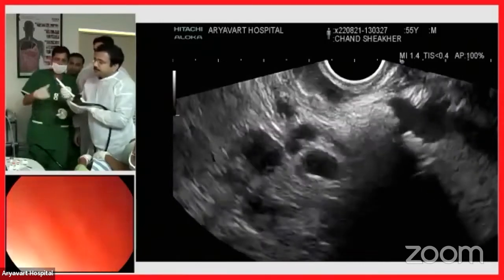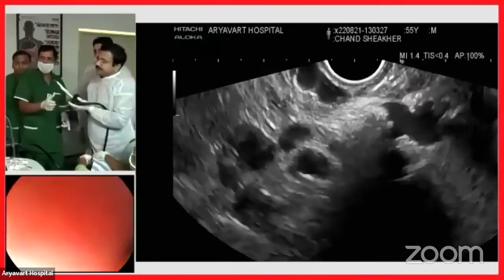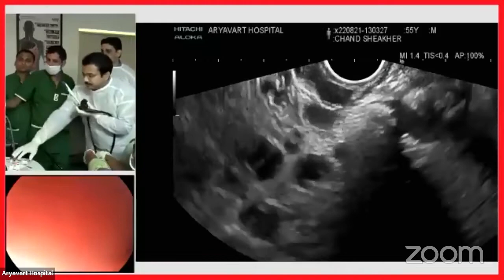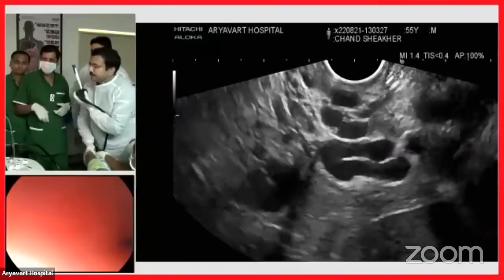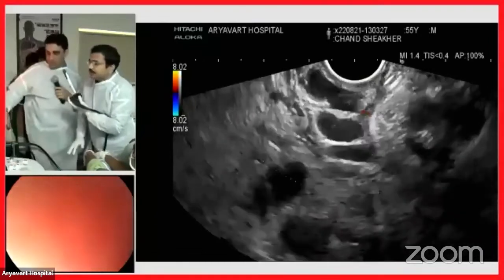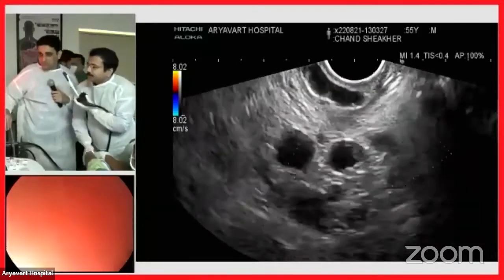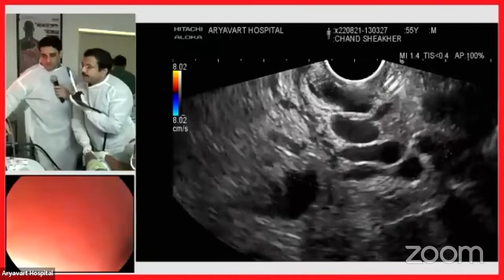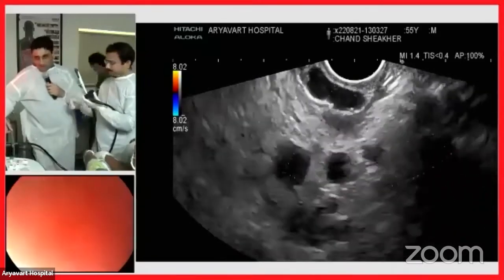The glue has been deployed and I take back the needle. Make sure the catheter is outside. You can see that once that has been done, there is no flow here. We trace it to the mucosal part — the blood flow should stop to the mucosa. You can see there are anechoic structures but no blood flow. The part where the varix was entering — we have blocked it — and the intramucosal part now shows no flow, where earlier there was a lot of flow.